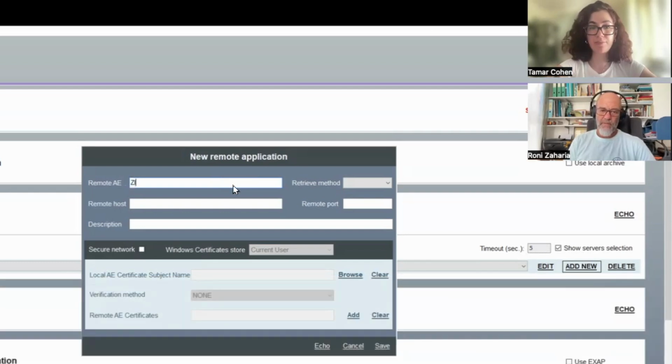Just in case our viewers are wondering where they should get their AE title from: when you configure something in your hospital or clinic, you will probably call your PACS administrator. That's the person in charge of the PACS, and he will give you this information.